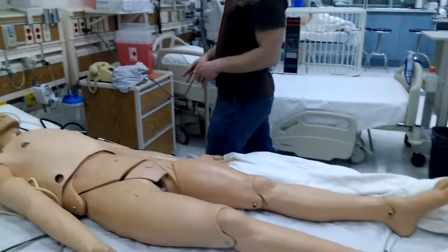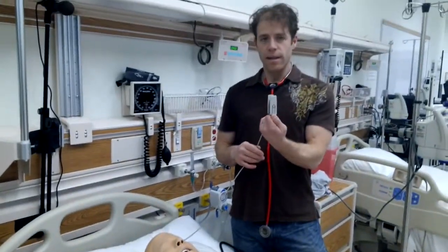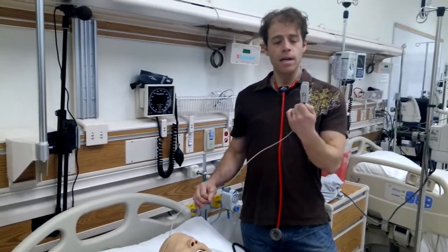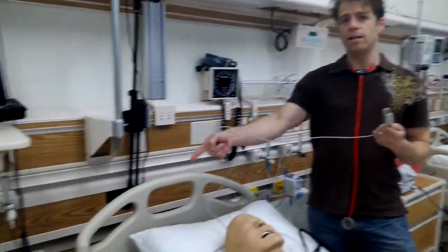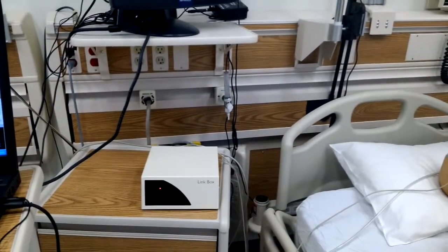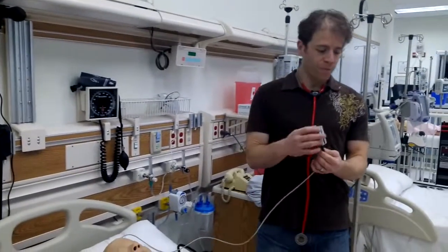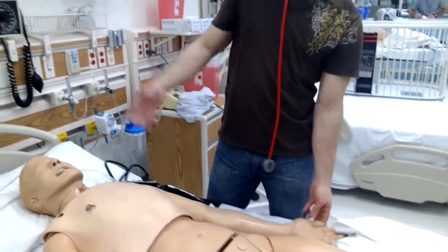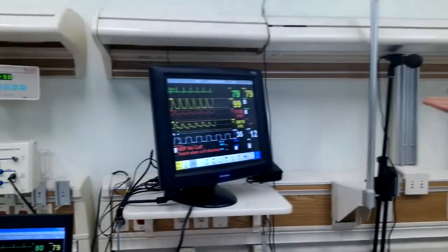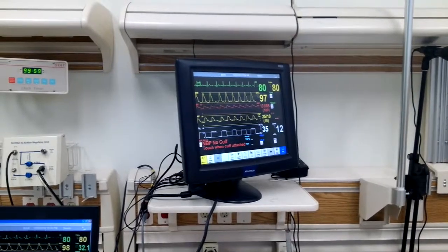Now, the O2SAT monitor is the same as what we saw on the 3G, except that it plugs into the link box — it doesn't plug into the patient monitor. So it does work the same. We open it up, we put it on, and on the monitor we get the O2SAT number and the waveform.